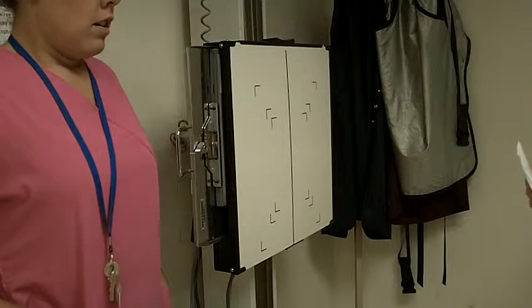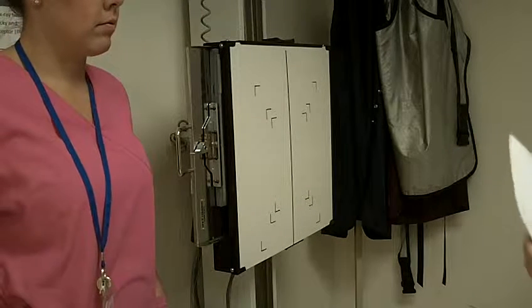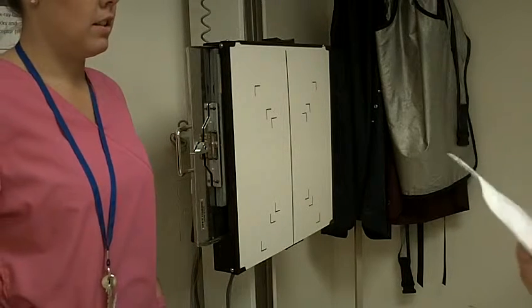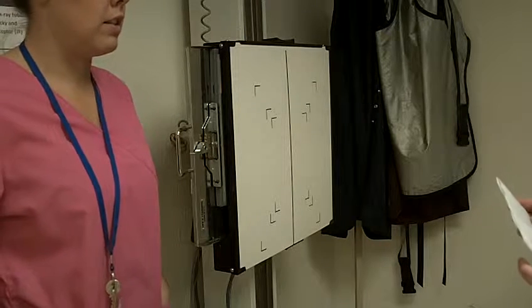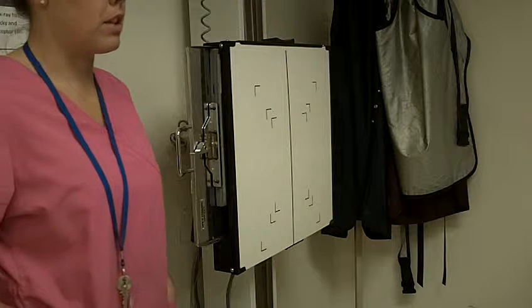It looks like you're in for your shoulder joints right here. Can you tell me what happened? Did anything happen to injure them or have they just been sore? I got in a car accident a while ago and they've just kind of been bugging me ever since. And how long ago was that? Probably like three or four months ago.